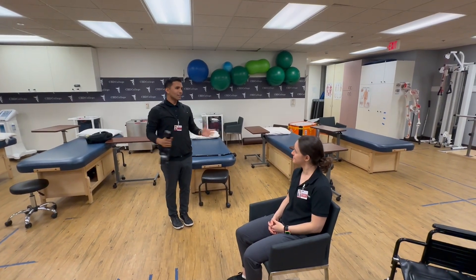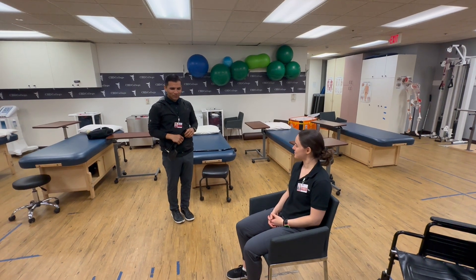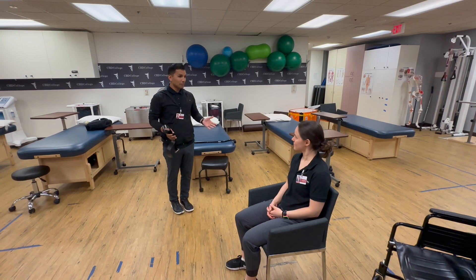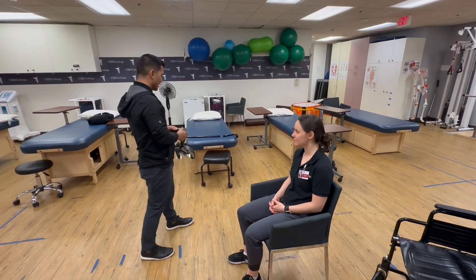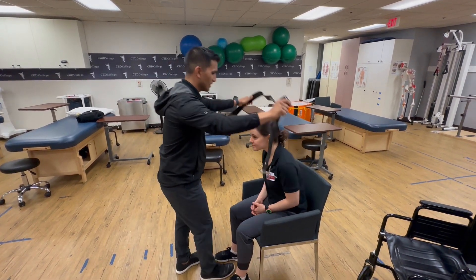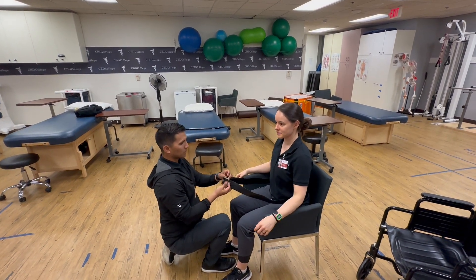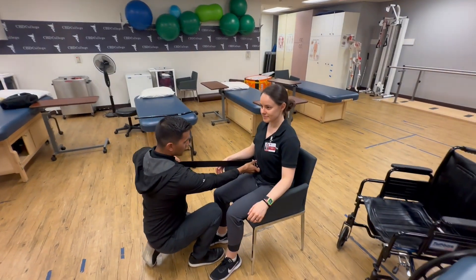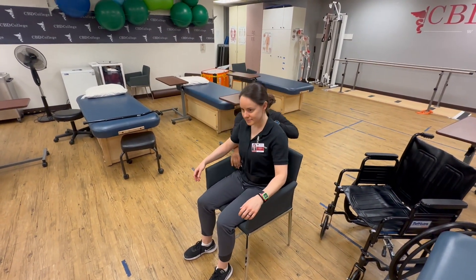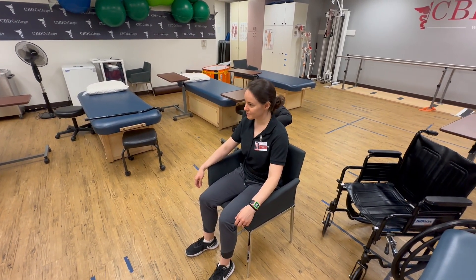Hello again, Andy from CBD College. I'm a physical therapy assistant student and we're going to continue on with some more measurements and get fitted for everything today. We're going to use a single point cane today, and I'm going to first start by putting a gait belt on. I'm going to wrap this around your waist — lift up your arms and get your arms down. This is just for protection and safety. It's not going to be too tight, but it's going to be a little tight.